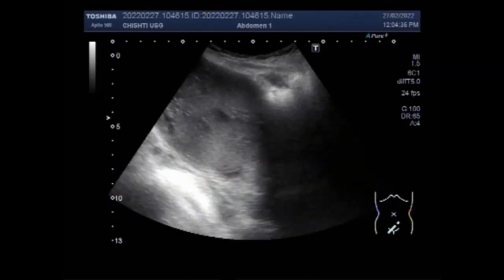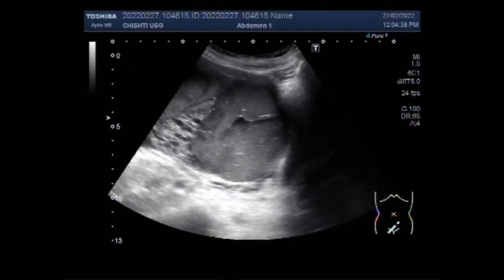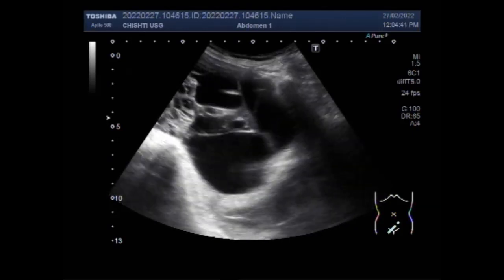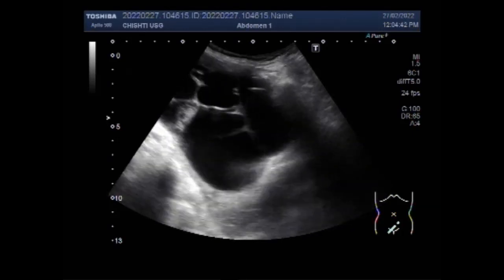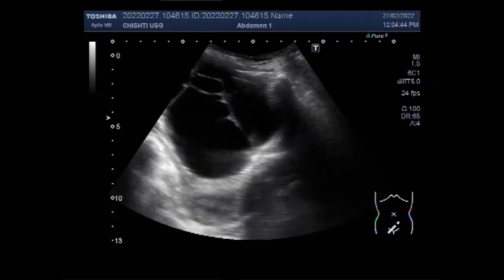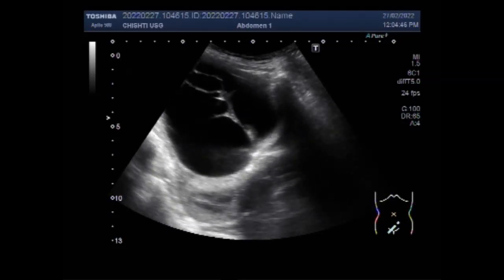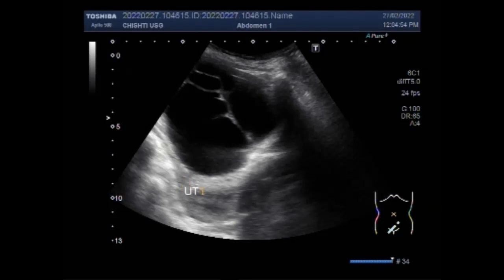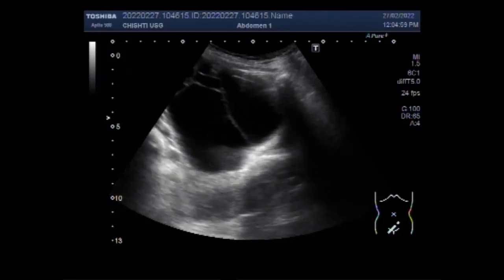Transvaginal ultrasound, especially 3D ultrasound, can help physicians differentiate between benign simple cysts and potentially cancerous complex ovarian cysts. For example, cysts that contain papillary structures, solid areas, and increased vascularity are more likely to be malignant.